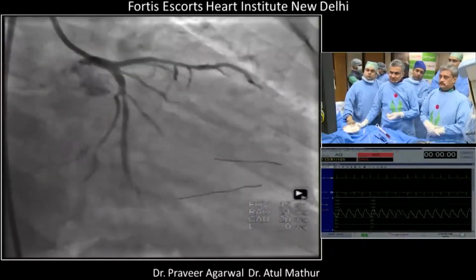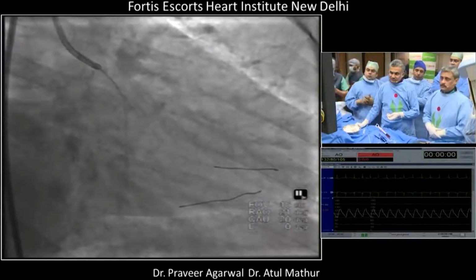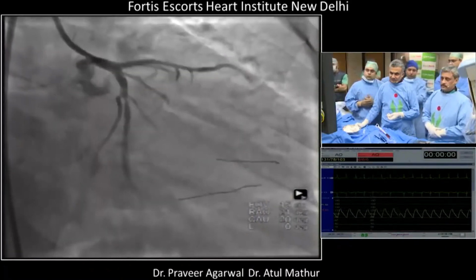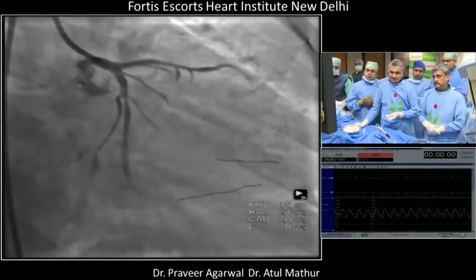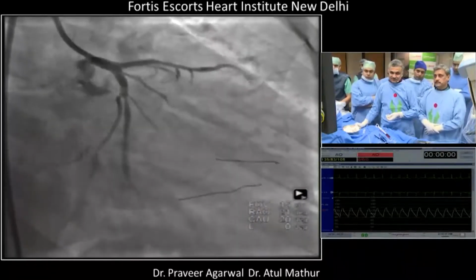And how about a two-stent technique with DK crush? Actually DK crush is what everybody is recommending, because I think even though you said there is no plaque, Atul, I think we have to prove that. No, actually, sorry, one more thing. How many people for V-stenting?